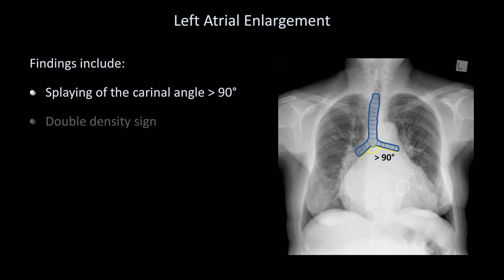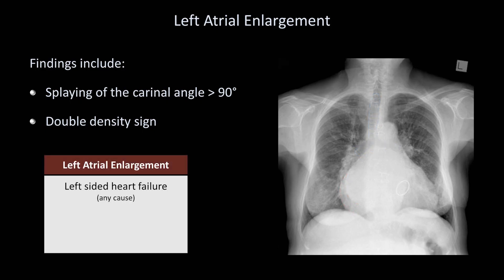The second finding is something called the double density sign. Usually the right border of the left atrium is not visible on x-ray because it is contiguous with the right atrium and lies right in the middle of the chest, where it gets obscured by other structures. However, as the left atrium increases in size, it stretches well across the midline and creates a second shadow along the right heart border. The dark red line here is the right atrium; the pink line is the left atrium. Etiologies of left atrial enlargement include any cause of left-sided heart failure, as well as mitral valve disease such as mitral stenosis, mitral regurgitation, or mitral valve prolapse.